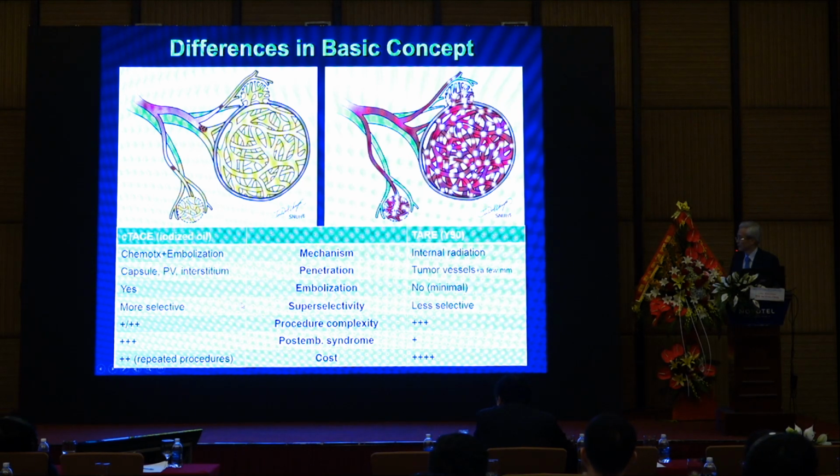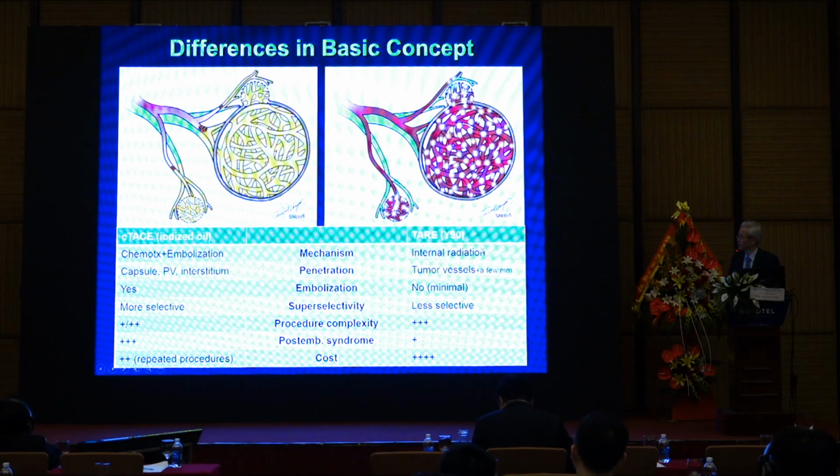However, the big difference is the selectivity. Conventional TACE is very, very selective, but radioembolization is basically lobar or segmental, so it's less selective. Procedural complexity is greater in radioembolization. Post-embolization syndrome is more severe in conventional TACE. Cost, of course, is more expensive in radioembolization.